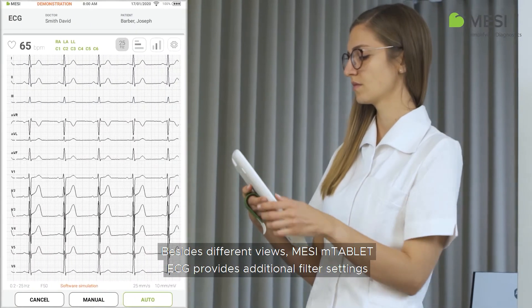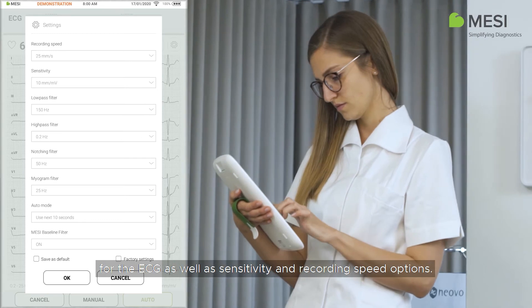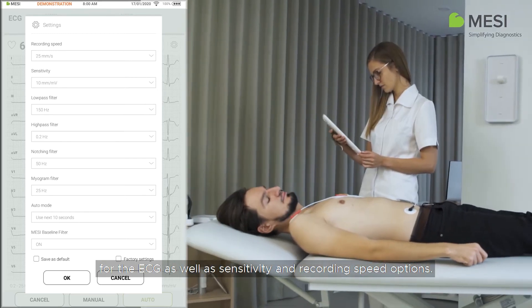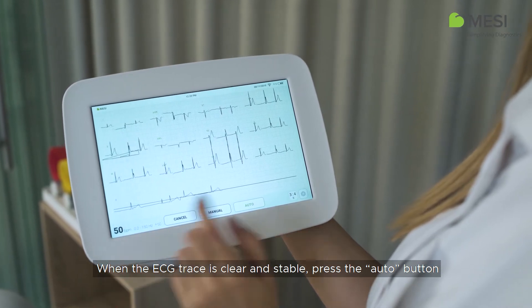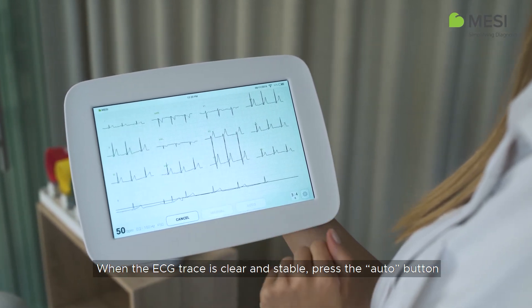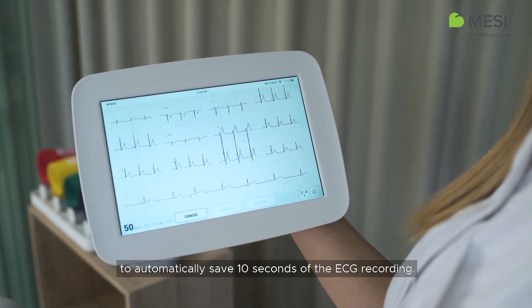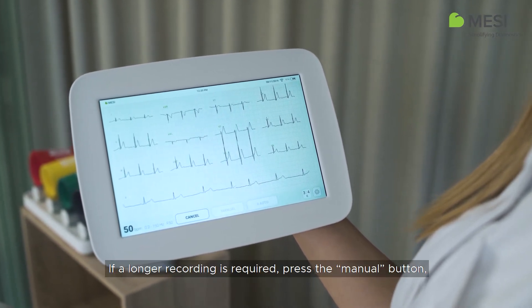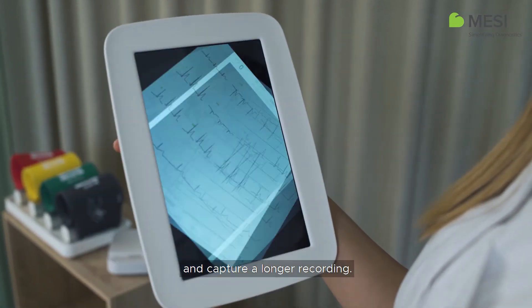Besides different views, the Macy M-Tablet ECG provides additional filter settings for the ECG, as well as sensitivity and recording speed options. When the ECG trace is clear and stable, press the AUTO button to automatically save 10 seconds of the ECG recording. If a longer recording is required, press the manual button and capture a longer recording.